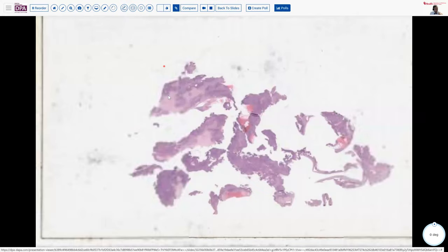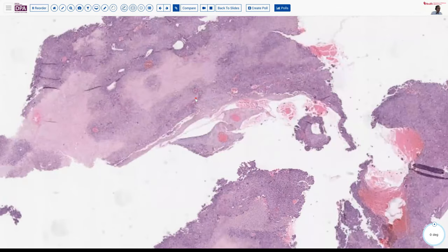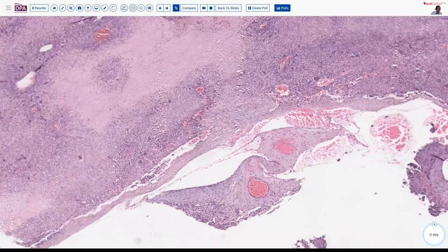All right, so let's take a look at the curetted fragments. And this again tells you that the surgeon was not terribly concerned about this because he went ahead and curetted the lesion. And as we look at this, we see there's, again, sort of like that dedifferentiated chondrosarcoma, some variable cellularity. We've got these more pale pink areas and then other areas of blue tissue, maybe a little suggestion of some vascularity or cystic formation as well. So we'll go down and look at some of these paler pink areas.